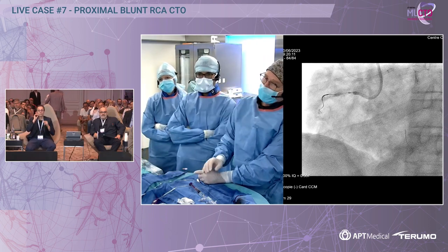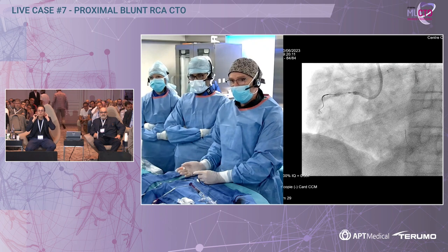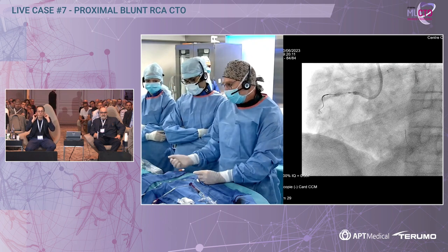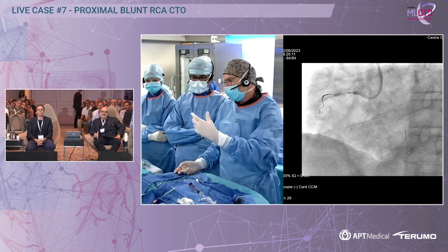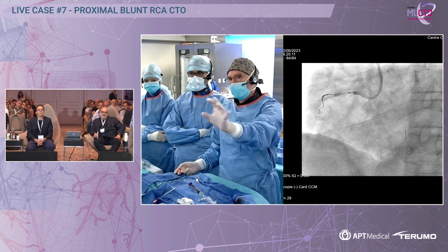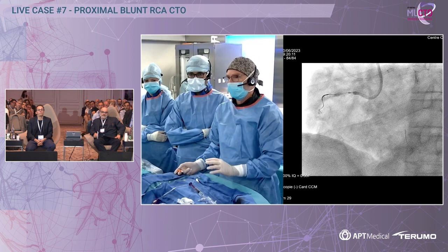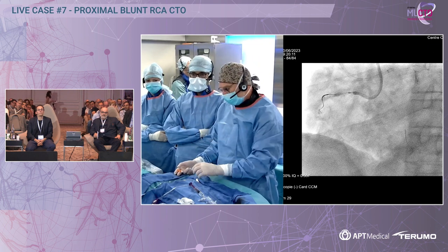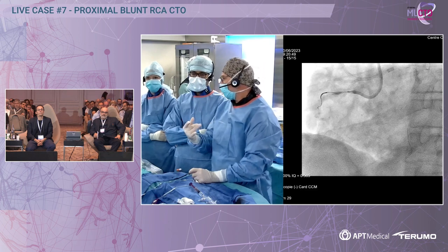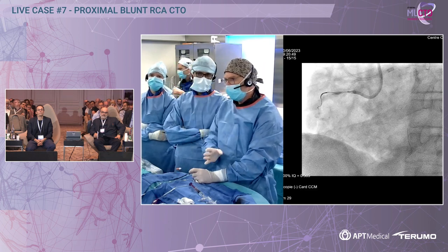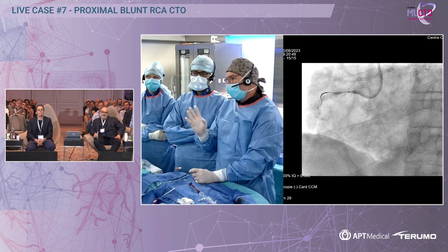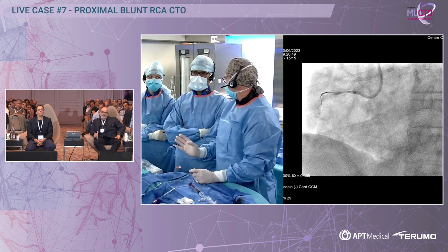Sometimes you get good news with the Gladius — the Gladius will go true to true. That's why I try not to knuckle at first. But here the Gladius is clearly going around the vessel. So my options are: take back the Gaia and make some directed attempts, or go for a knuckle now and then pursue the retrograde strategy. What do you guys say?